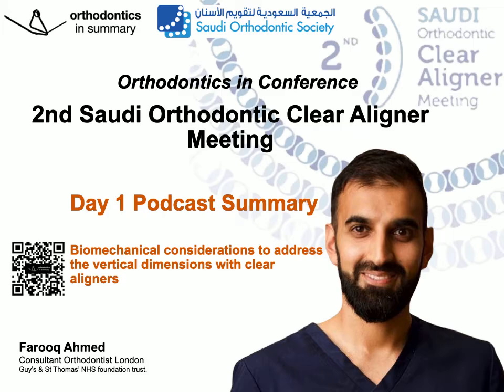Next, Maz described torque. He described the wagon wheel effect taking place. And just to summarize what that is, well, each time we put torque into our teeth, we're also getting some mesial tipping off the roots, or some distal tipping off the crown. Now in our conventional fixed appliances, that's already built in. For our torque, we get an offset of mesial crown tip. But for aligners, we also need to consider this. When we're putting excessive torque in for whatever reason, we need to ensure that we've got offset of mesial crown tip to prevent the wagon wheel effect occurring.